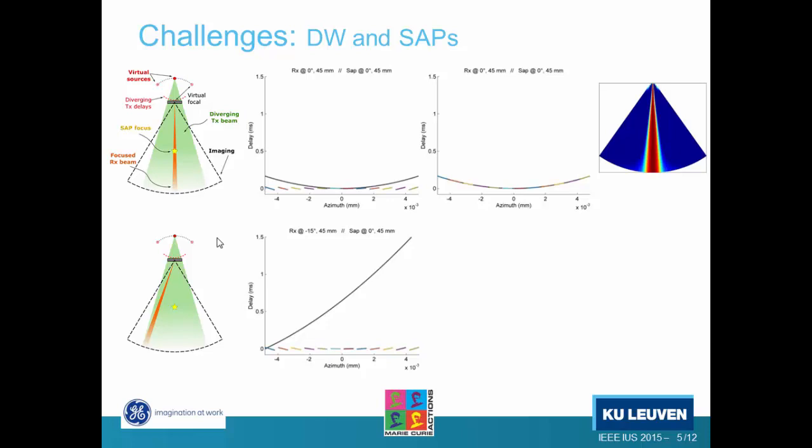So these elements were already pre-steered in the first case. They have the same focal point for the SAPs. And then we pass them to the system, and there we can again delay these channels according to the desired direction. And what we see is that the SAPs align with the theoretical delays, or at least the SAP centers.